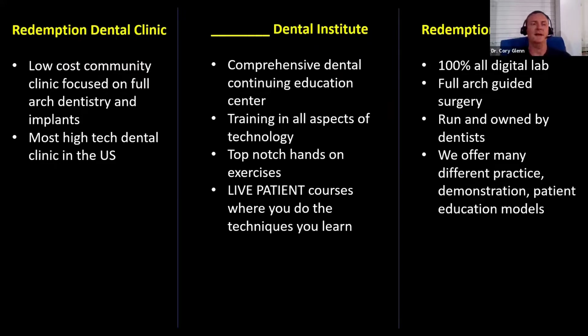It's crazy. We've got a Carestream 9600 cone beam that does the whole head. We've got a facial scanner built into that. We've got a Shining 3D facial scanner. We've got the Instarisa facial scanner, and we're doing a lot of work with combining facial scans and really doing facially driven treatment planning and delivering services. So super excited about all that's coming.